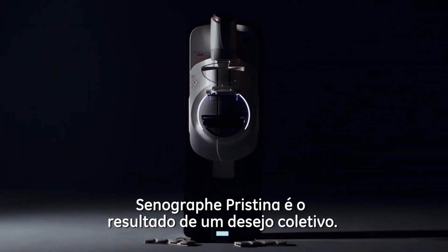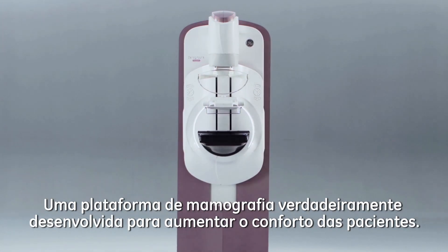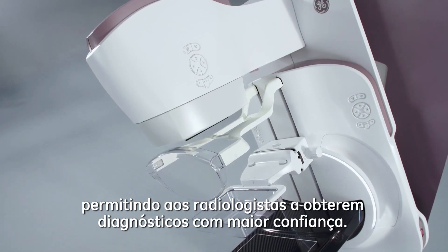SeneGraph Pristina is the result of a collective desire to create a mammography platform that's truly built around putting patients at ease, making technologists' jobs easier, and helping radiologists diagnose with great confidence.